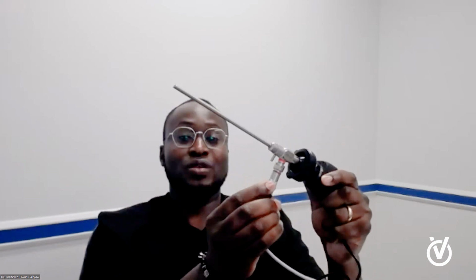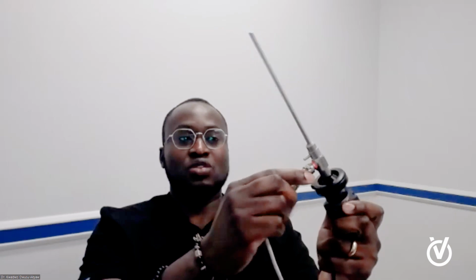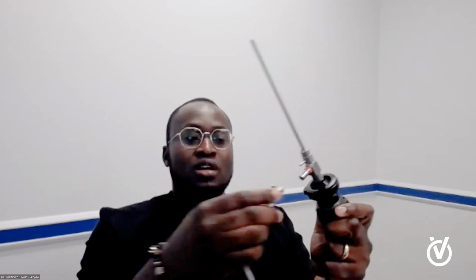Attached to the scope is a lens, and that lens kind of allows us to change our view, almost like a periscope on a submarine. So it's like you're looking up and around the corner. So I can take this little handle here and turn it side to side, and I'm looking up and around inside the joint all around to do what we need to do. And now this is just a sample, but there's also a light cord that runs up into the camera here. This cord is that light cord. And it basically shines a light through the camera so I can see inside.